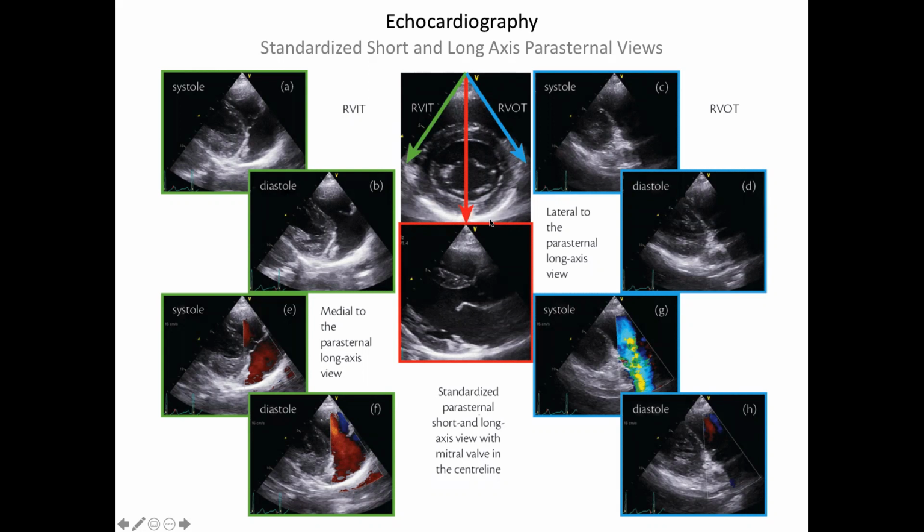And so the physician goes through those, and they usually have a good relationship with the tech, so they know what's coming next, right? So it does the same thing every time, but it's something that gets built up over time. How you do that, which one comes next, what the settings should be on it, and things like that.